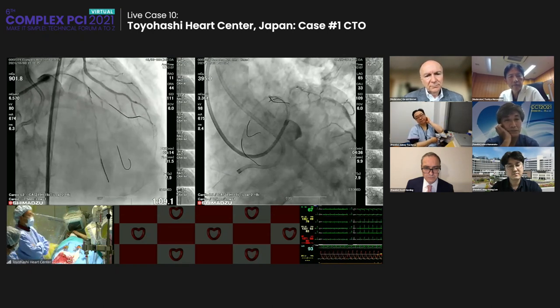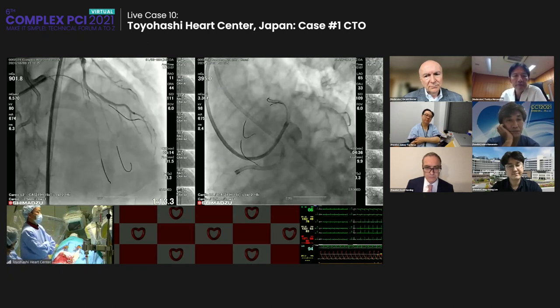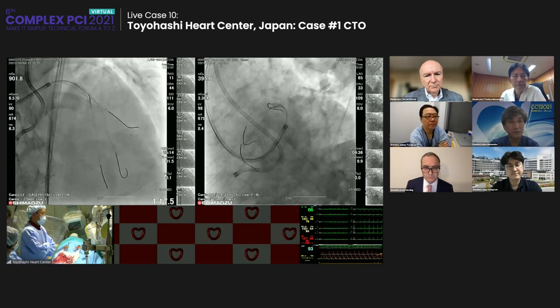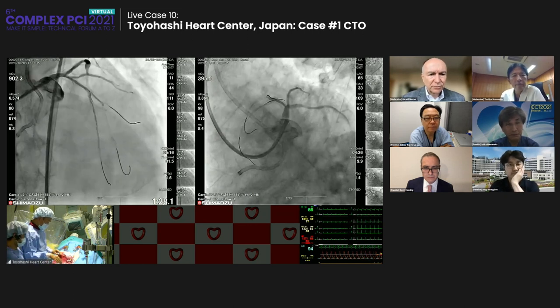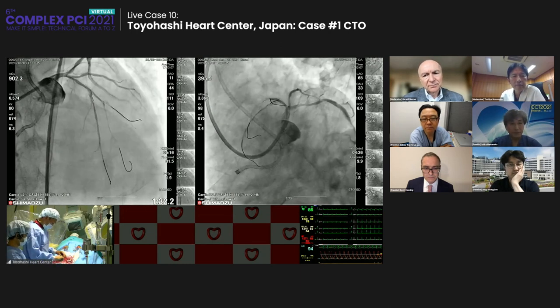You have four atmospheres or what? Yeah, three, just three. Okay, check the angio.